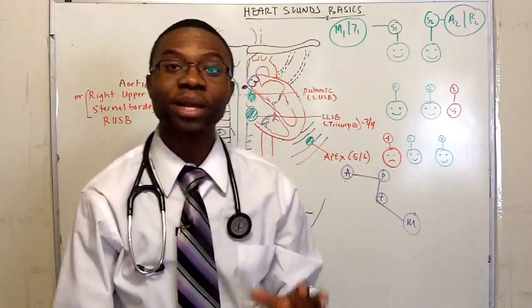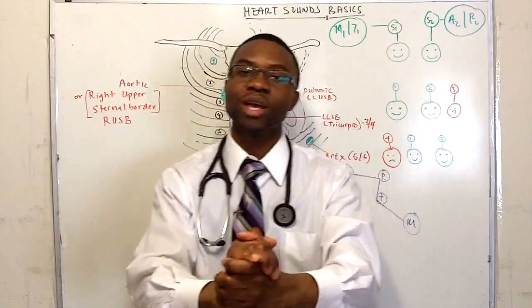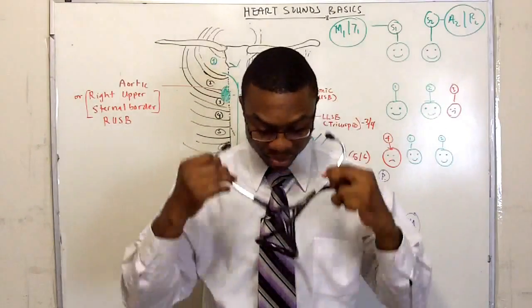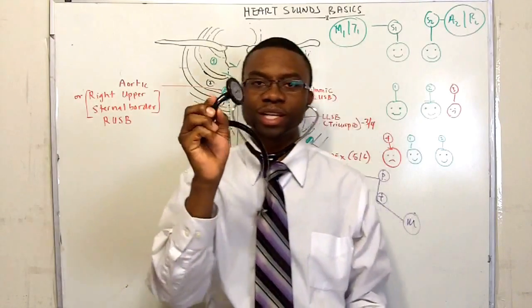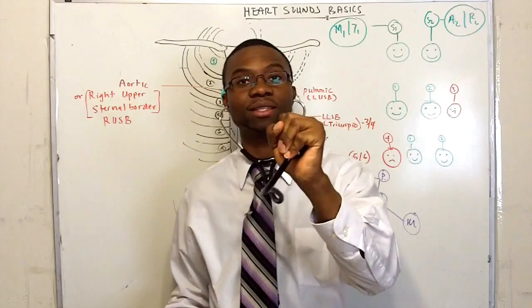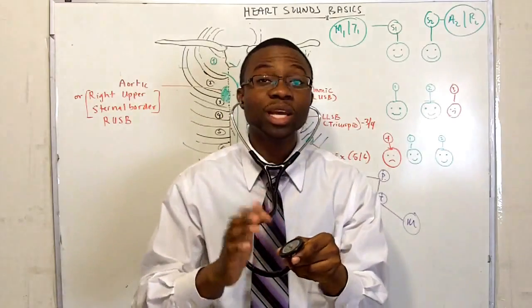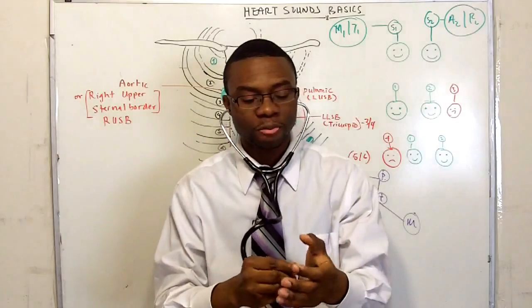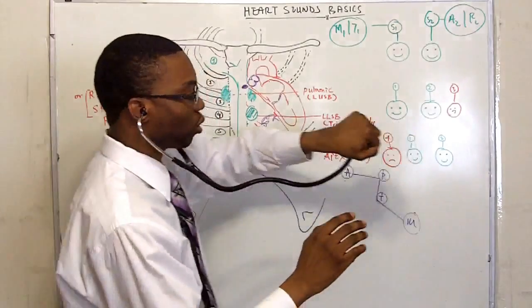So I'm going to make an illustration, and from now on, this is how you're going to learn heart sounds. And you will never forget. Take your stethoscope and put it around your ears. And I want you to take your stethoscope and place it inside your hand. Now, the reason why I say this is never do this. It's very deafening. It's not good. So you close your hands, and I want you to hold your stethoscope like this high.